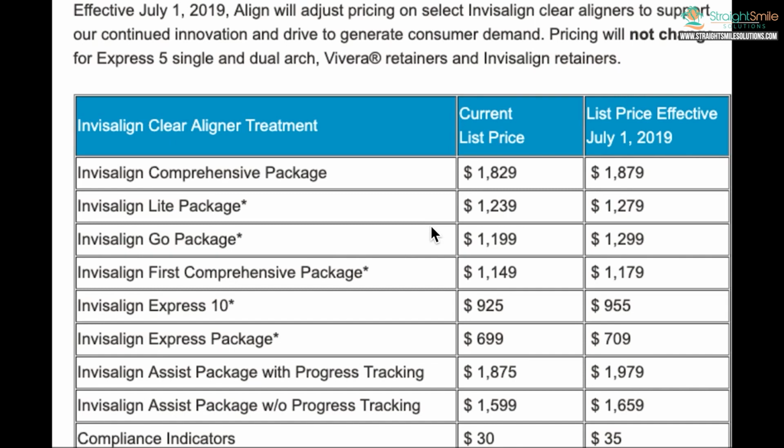And then later, as needed, I'll straighten the front teeth at the end of phase 1 or later in phase 2. So I do the same thing, all different ways to go around it, but this is all together in one. Invisalign 10, we've had that around for a long time. Again, there's limitations. I don't think with 10 you can have precision cuts, you can't have rubber bands. There's limitations on revisions, refinements as well, and certain types of movements.